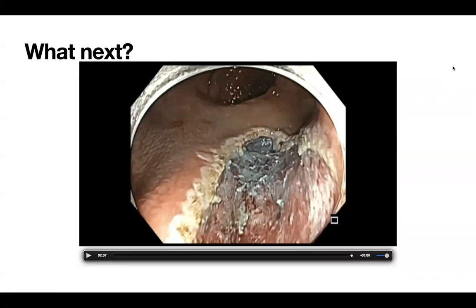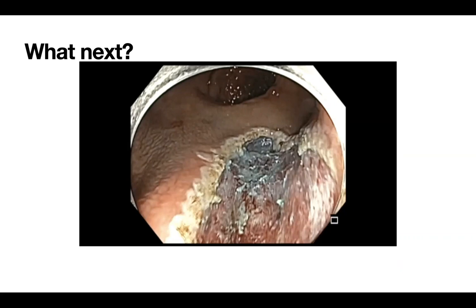I did not see a clear-cut hemorrhoid before the procedure was done. So that is not what I'm saying. But once the cuts are done, I see Roy's point of exposed hemorrhoid vessels that we see after his first or second cut. We are able to see the underlying exposed vessels and venous engorgement, the hemorrhoidal engorgement. That's my take. Okay, that's good.